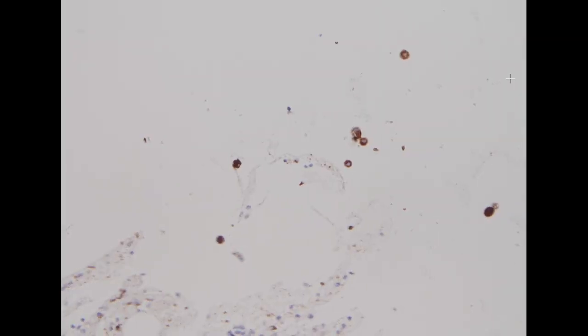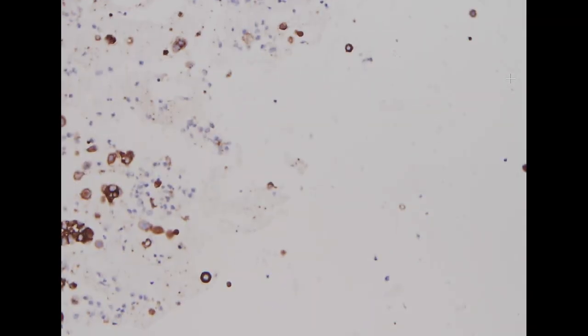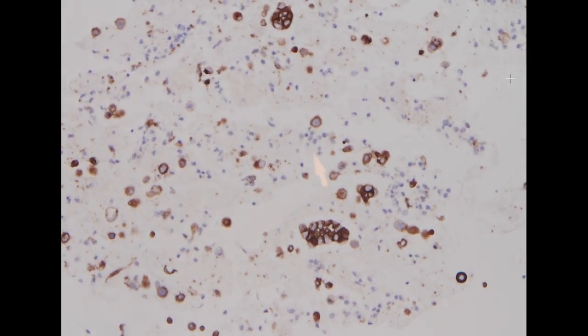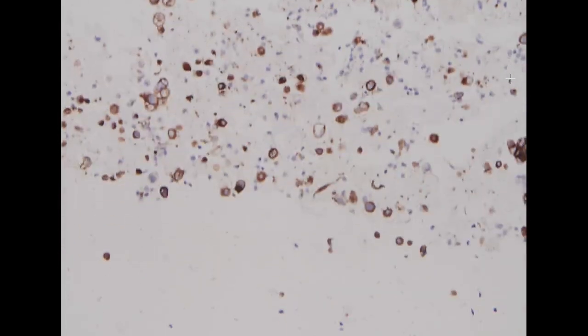So you can tell that there are more tumor cells presenting as single poorly differentiated cells than we expected. And again, the tight clusters, these are definitely adenocarcinoma. But the problem is the single cells in the background.